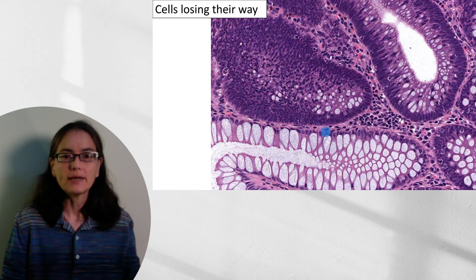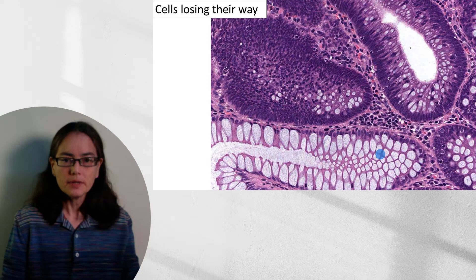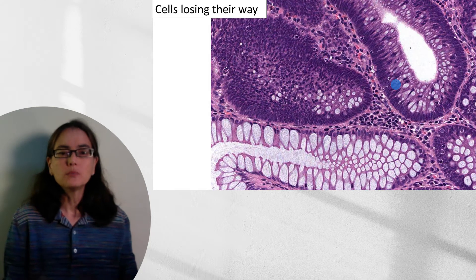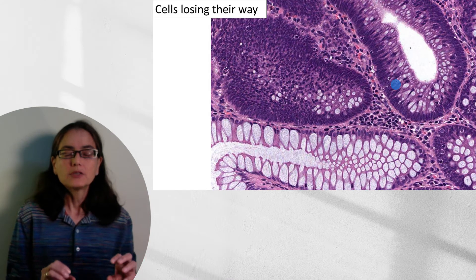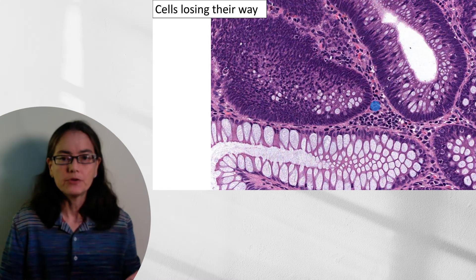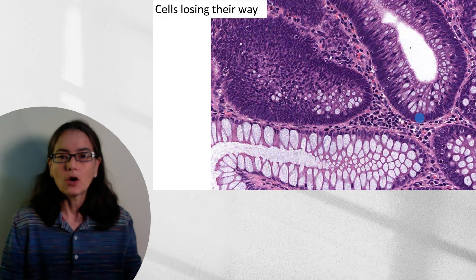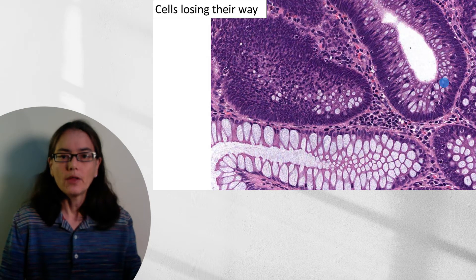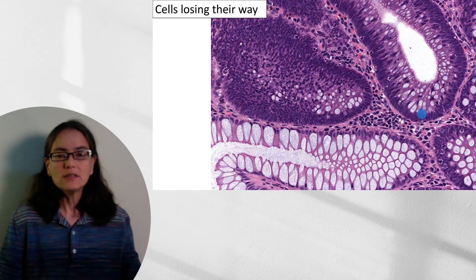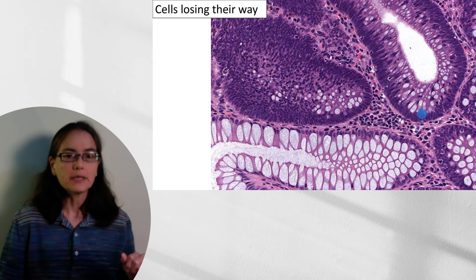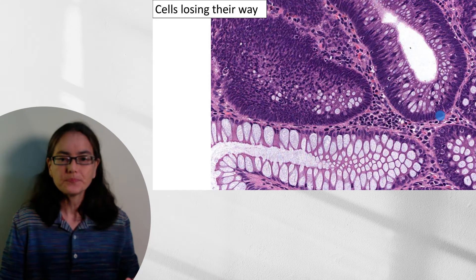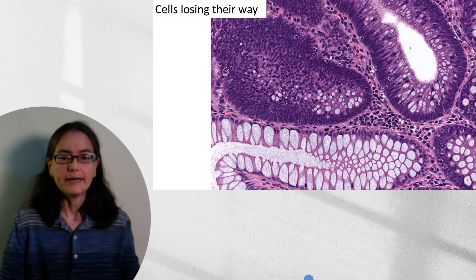The well-behaved cells have a nice basal nucleus, maintaining their polarity, and are happily making mucin. Compare that to these dysplastic areas — this is dysplasia, not frank malignancy. It's the first step before we get to pleomorphism. These cells are not making nearly as much mucin, the nuclei are enlarged and dark, and some have left the basal surface and are up closer to the lumen. We'll also typically see enhanced mitotic activity. These cells are losing their way but haven't gone completely malignant — they're still bounded by the basement membrane.